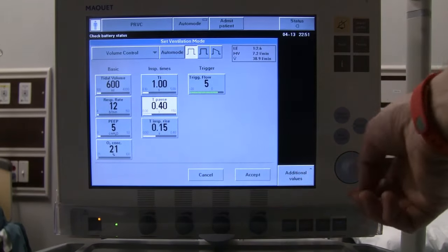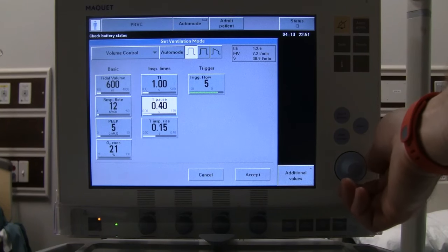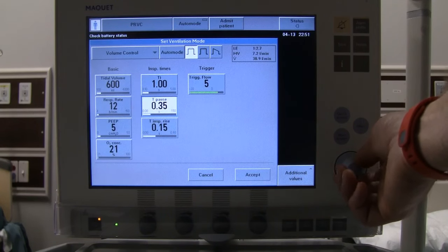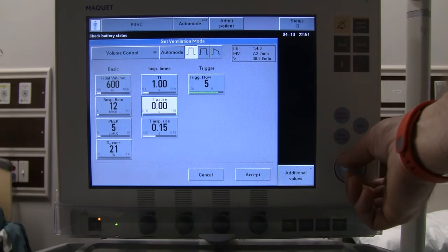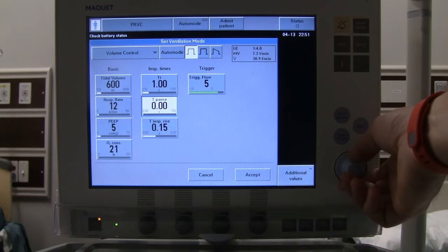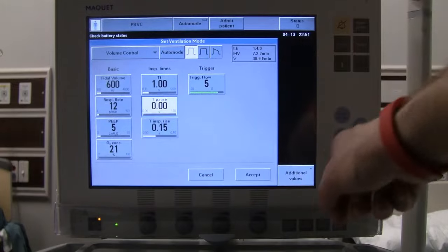The ventilator defaults to a T-pause — a timed pause. In older ventilators this was used to obtain a plateau, but we don't want to set a pause for every breath, so we dial this back down to zero. By doing that, it also changes our I-to-E, because holding a pause on each breath makes the I-time longer.